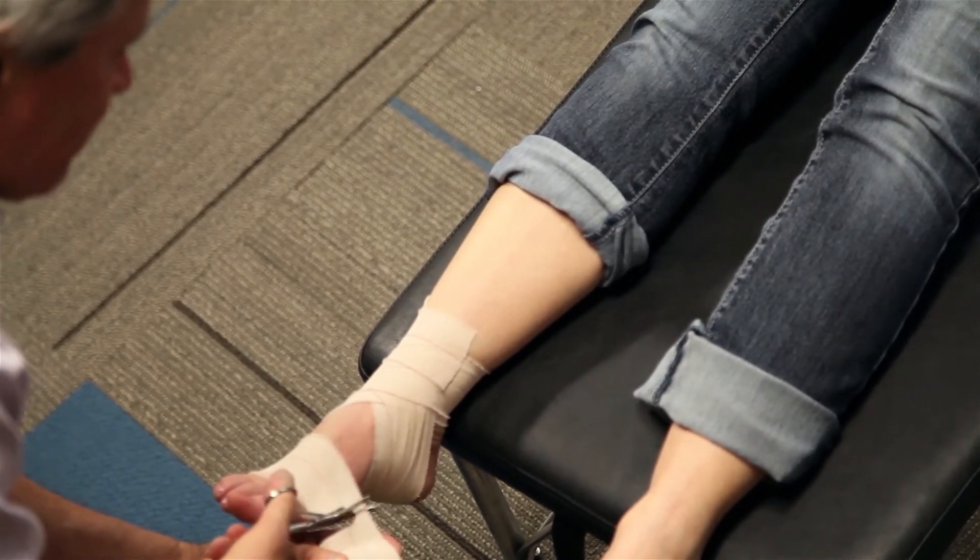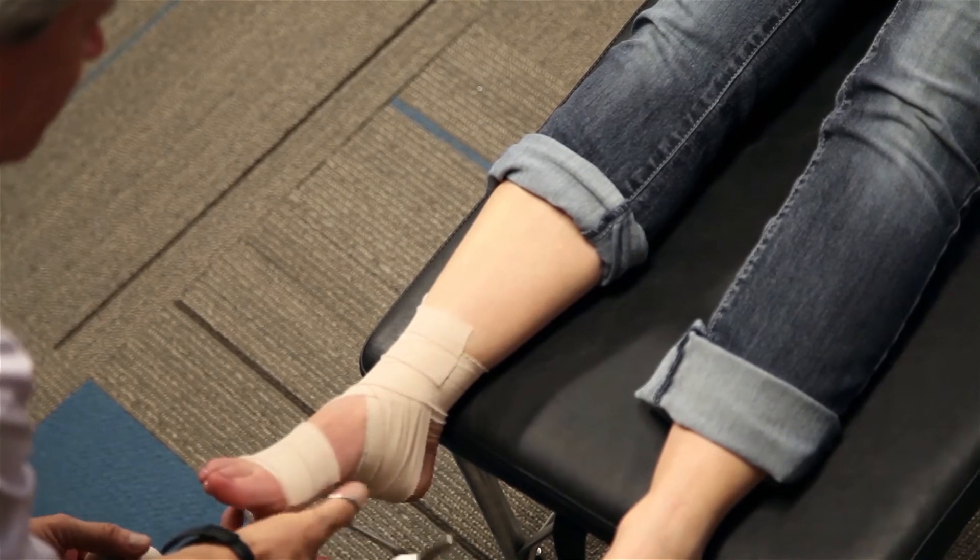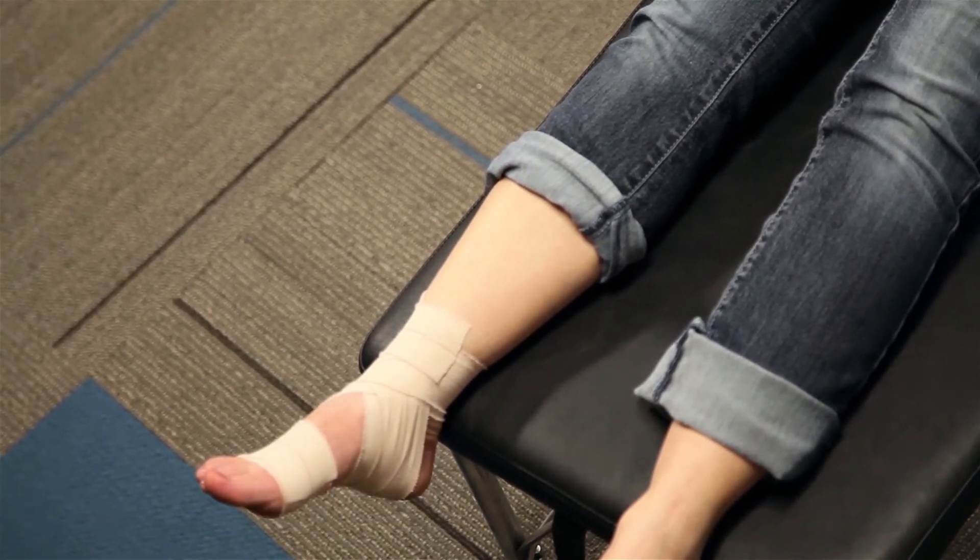This will provide temporary stability for the foot for approximately one week.